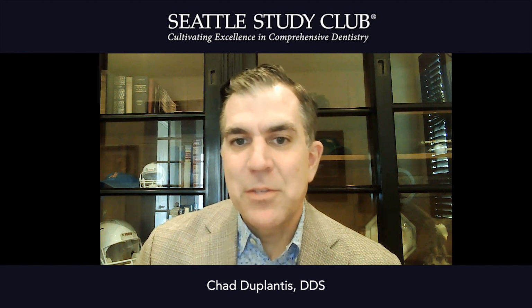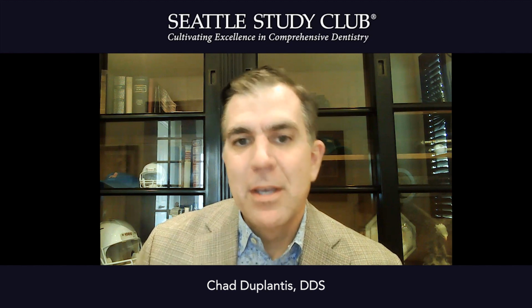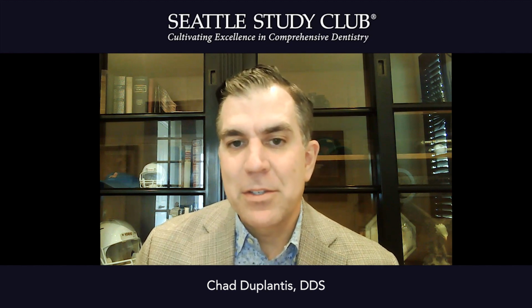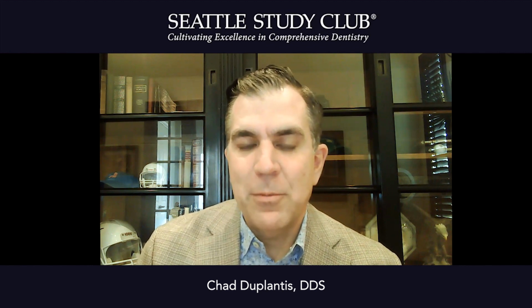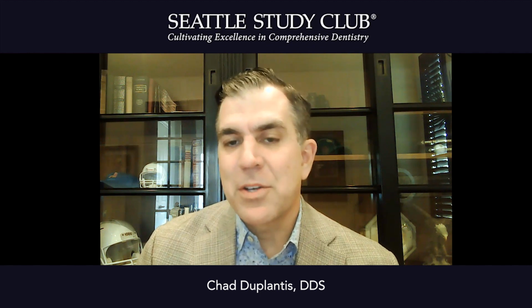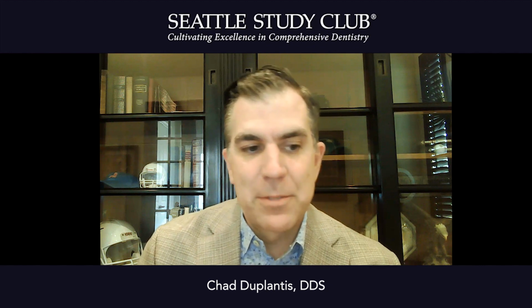The P stands for the Panorex. Each of these CBCT systems creates a two-dimensional Panorex in addition to the three-dimensional views of the CBCT. That's the first thing that we look at. We take an overall view of the Panorex in 2 dimensions, and then we can start to annotate some things that we need to look into further in the 3-dimensional image.